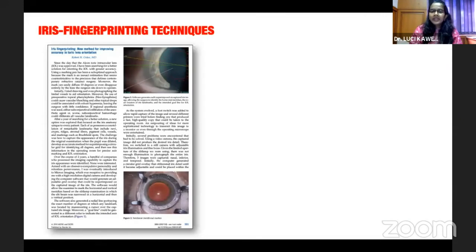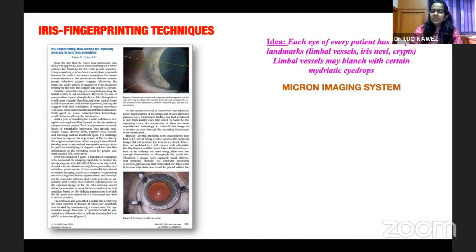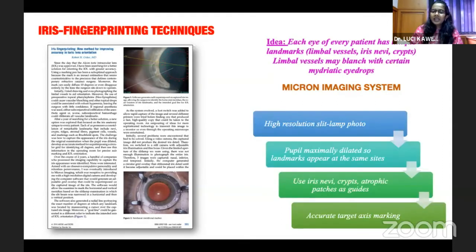The iris fingerprinting technique was introduced by Dr. Robert Osher. Using the Micron imaging system, a good quality digital photograph is taken of the patient, and based on the crypts and pits on the iris, a reference marking can be done. This has to be performed with a fully dilated pupil so that it simulates the conditions in the operating theater.